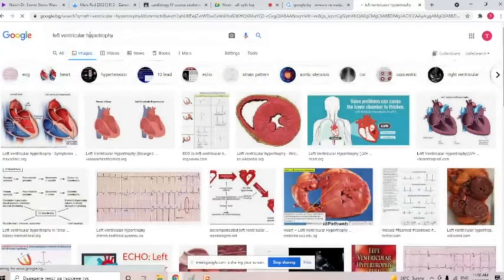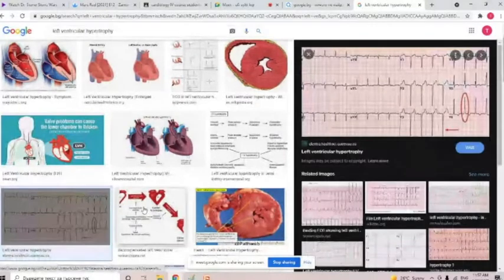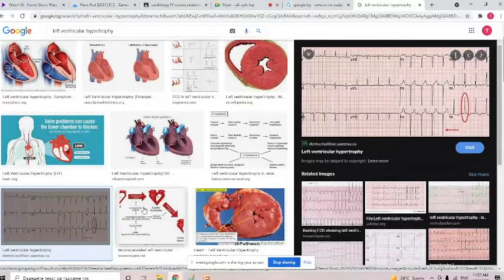LVH? What is this? What is it for? So if you've got hypertrophic muscle, you've obviously got a lot more depolarization going on, so it's going to look bigger. Yes, but can you have higher amplitude with normal, let's say, myocardial mass, not hypertrophic? Probably. Yeah. In hypertension? Anemia? In hyperkalemia? I'm talking about the QRS, not the Q wave. But you can have it, especially usually in women because their chest wall is so thin and the conduction can be visualized quite easily. And in children as well, and in skinny people mostly.